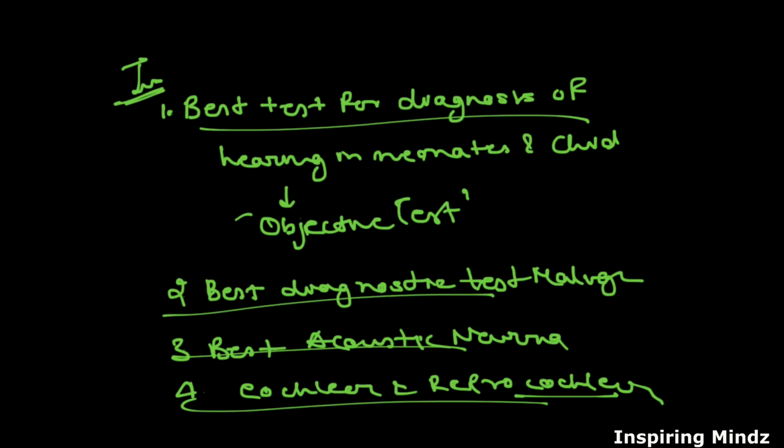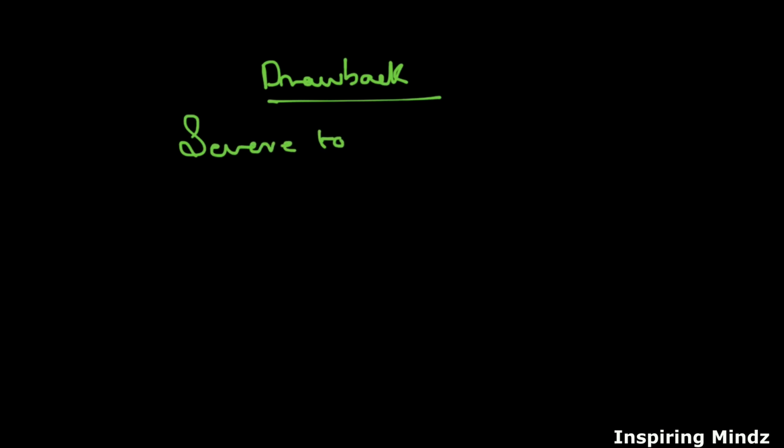Okay, so now what is the major drawback of BERA? The major drawback of BERA is when the patient is having severe to profound hearing loss.